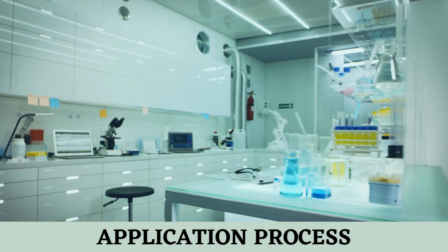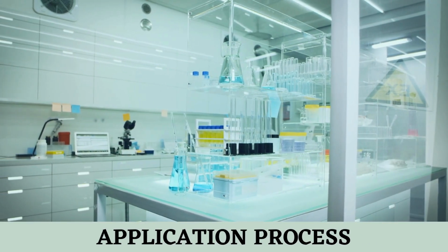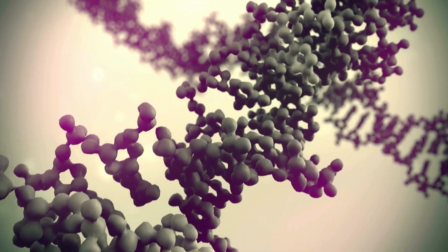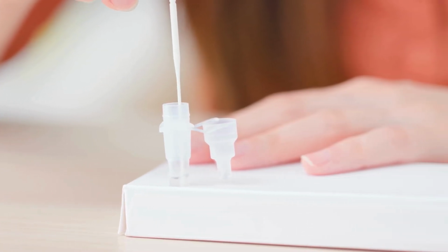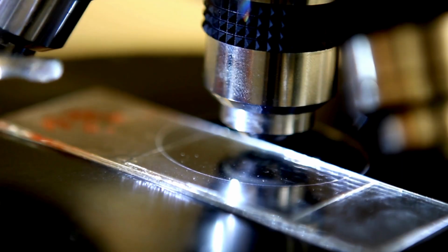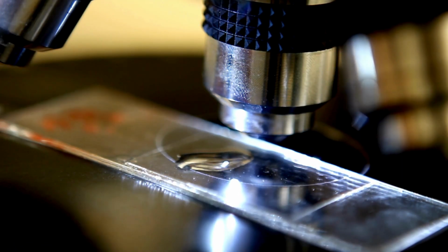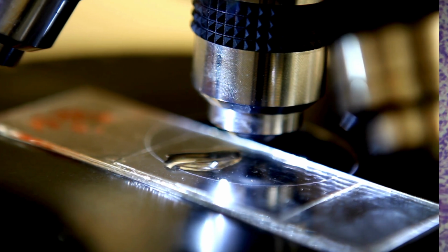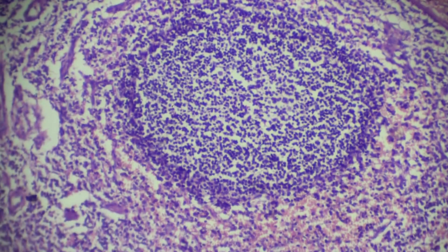So now, we touched upon why immunohistochemistry is important and how it serves a purpose. But how is it applied? Well, it relies on antigen-antibody reactions, essentially a chemical reaction between two protein molecules. When targeting antigens within a tissue sample, immunohistochemistry utilizes antibodies as a start. The antigen itself acts as a marker. If the antibody within the tissue sample identifies the antigen, it will then be bound to it. With this binding process, the tissue sample will be stained a color, which provides lab technicians with results according to the color observed. With this observation, disease diagnosis can be put in place effectively.